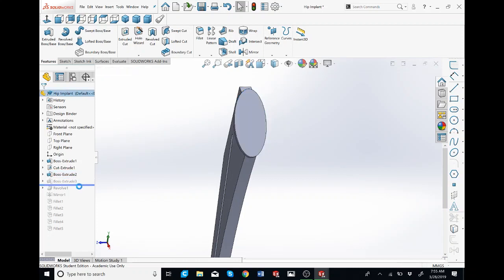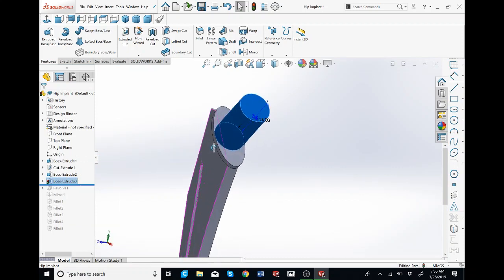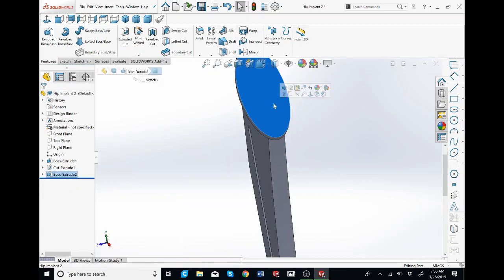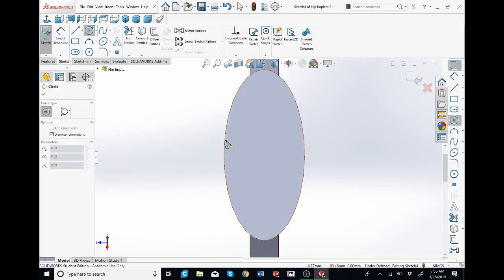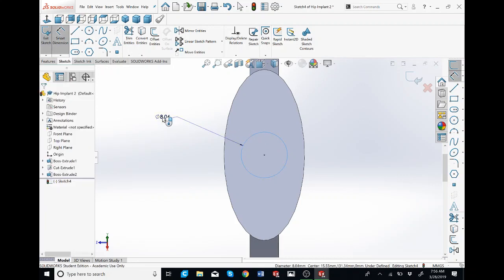Scrolling this down, oh yeah, I have it as 14 for the circle, and it is 25 going this way. Okay. So I'm going to click on this face, hit sketch, and zoom in. I'm going to create a circle over here. You see if I hover over the edge, this center will pop up showing it's the center of the ellipse, and that's what I want. So I'm going to click on this. It doesn't really matter what size it is because I'm going to dimension it. Click on smart dimension, and I believe it was 14.